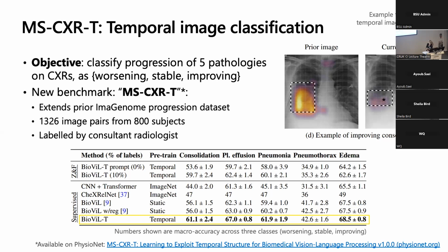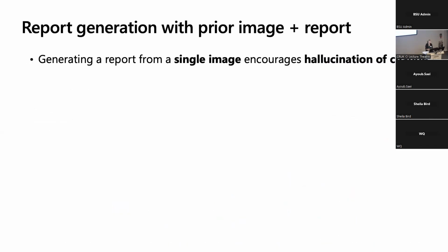I should note pneumothorax is extremely challenging. One of the reasons we think this is because many pneumothorax cases are very, very small and quite difficult to see. And we're using, I think, images that are like 508 pixels across. So we probably need to work with higher resolution images to be able to see the change in a pneumothorax. Great, we're doing okay for time.